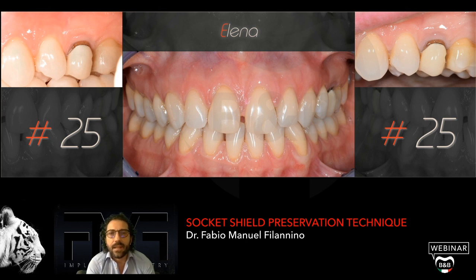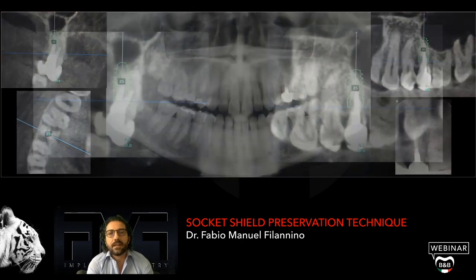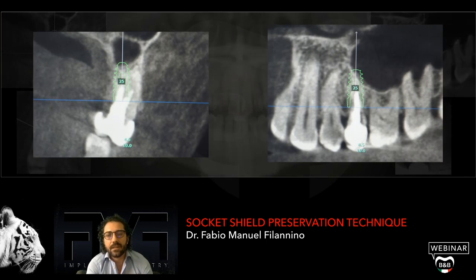This is Elena, a patient. She's a young, beautiful lady who came to our office with an emergency, and she had to have the second premolar extracted. So I looked carefully at the X-rays and at the pre-op CBCT scan, and I saw that it was not the perfect situation to perform an immediate implant.